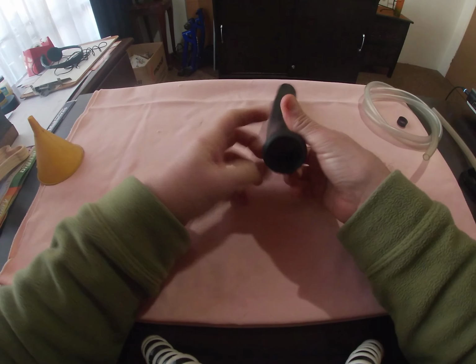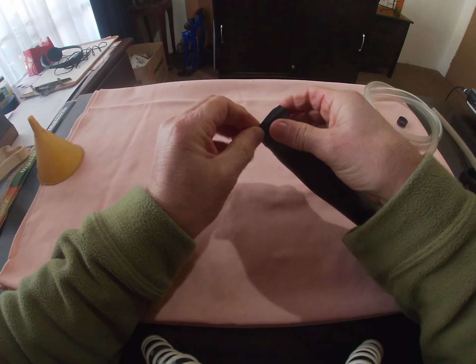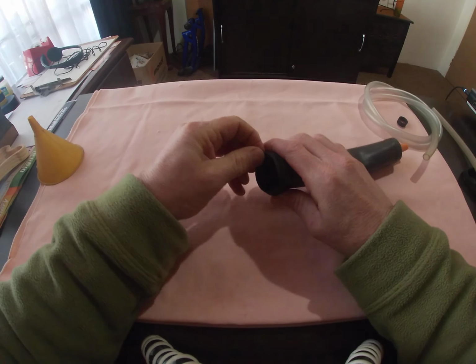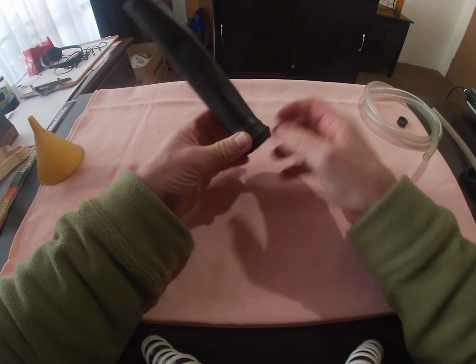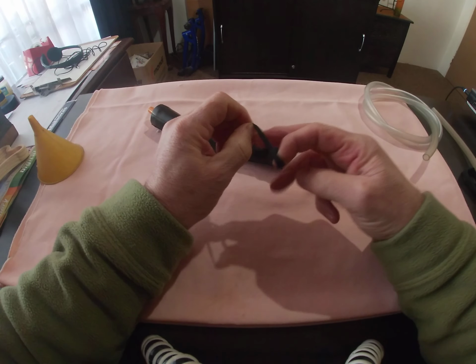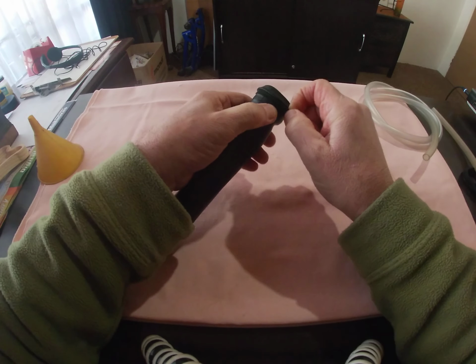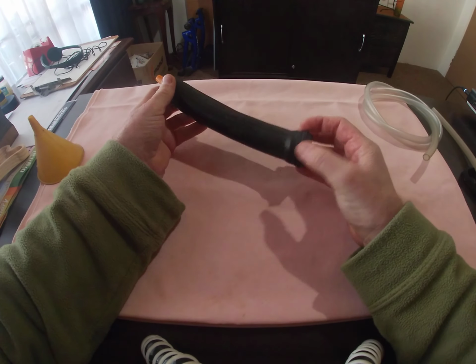And there we go, and you can see if there are any sharp edges from the cut, you can pull this over and it will protect you from the sharp edges, but you can also sand that down and work it as you need it. If you look at it, it's not going to pull out here. If you want, this is a smaller piece I cut. You can just put this piece over here if you really think it's going to pull off. I just put it on there for security, but I don't even think it's necessary.